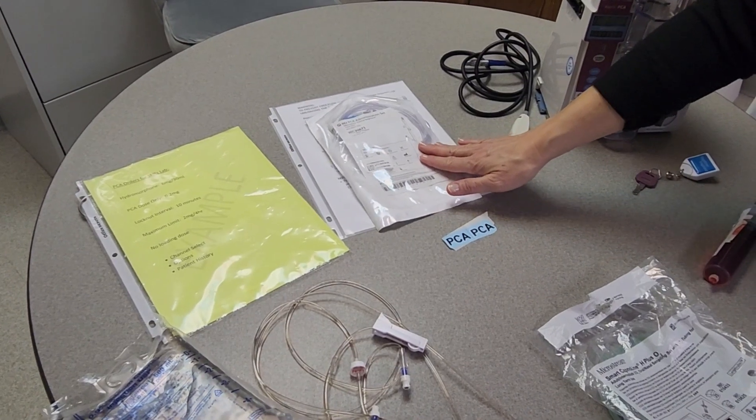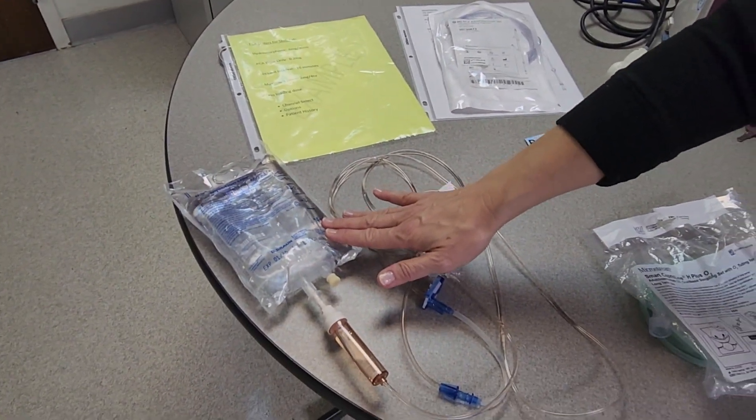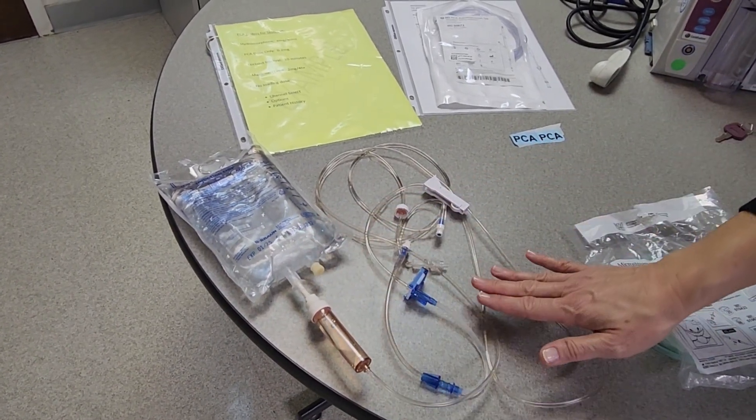Inside this packaging you will find directions on how to prime the tubing should you need that. You will have to get your carrier fluid from your order set — it should always be normal saline, and you will need to prime your IV tubing with that.